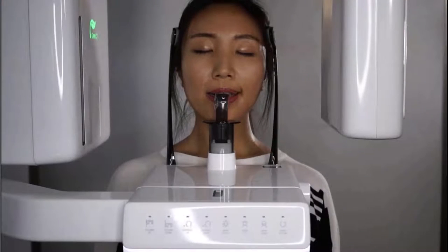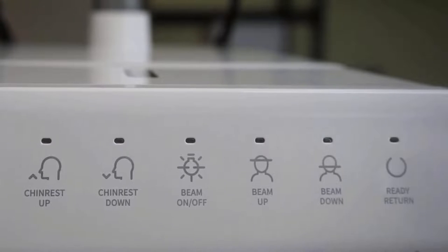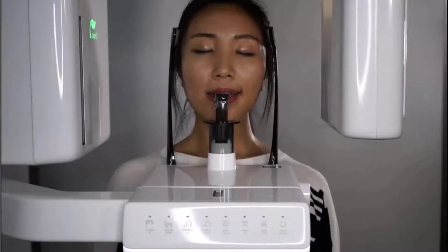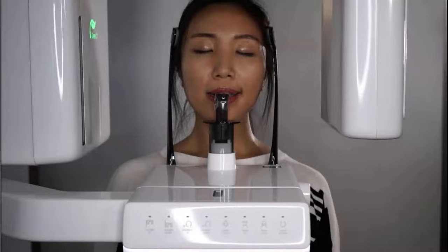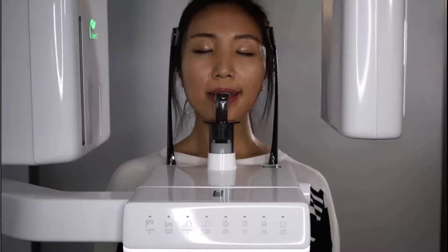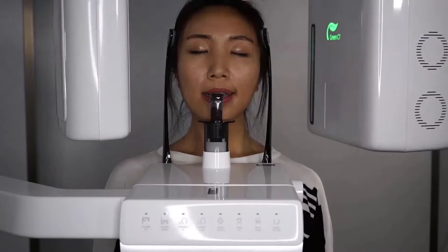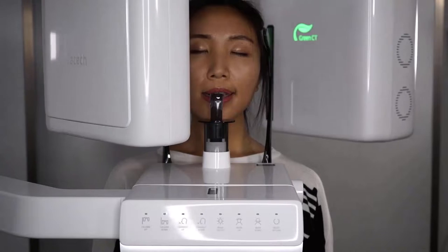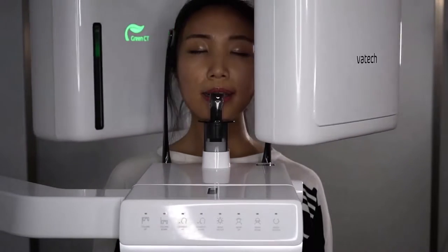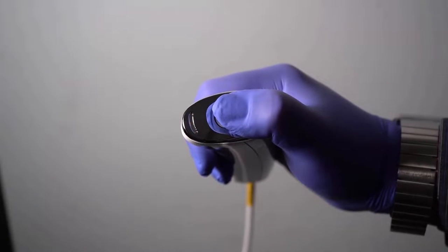Once complete, simply hit the ready return button on the front of the unit or the computer and the machine will rotate to acquire position. Have the patient close their lips around the bite stick, swallow, and keep their tongue flat against the roof of the mouth. To acquire an image, hold down your exposure button — which will be lit green indicating ready — and it will turn yellow once exposing. Hold until complete.